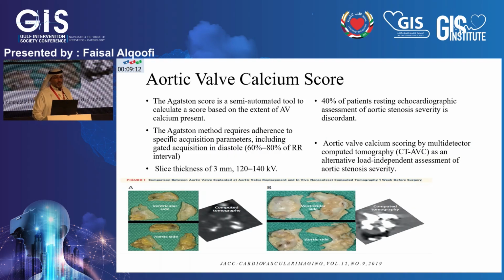So now as a TAVR operator, you get the TAVR report from whatever platform, and you look at the calcium score. Truthfully, we look at the calcium because we are looking for high calcium to help us with the procedure. But let's dig deeper a little bit into where the data driven from the calcium score came from.